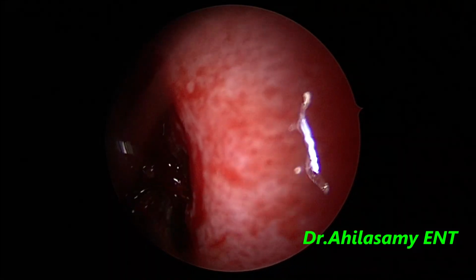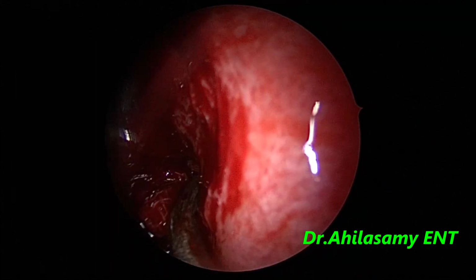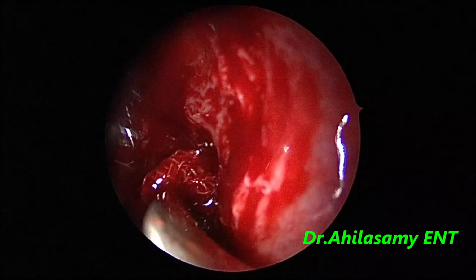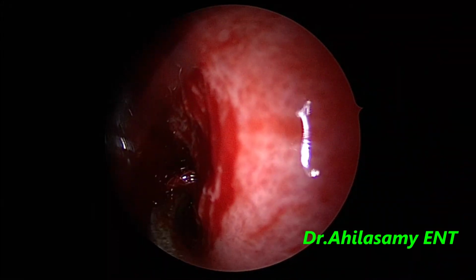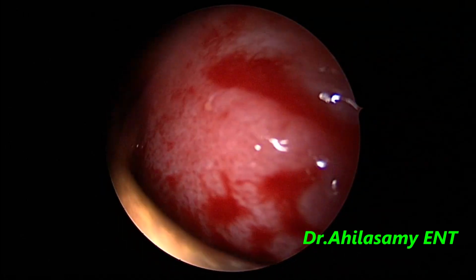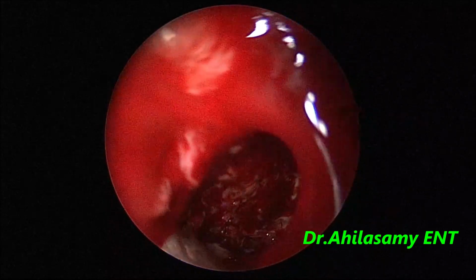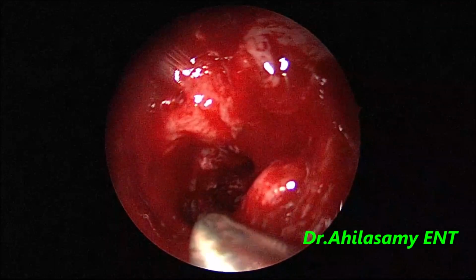Still the field is a little bloody, but lesser than the GA field, unlike the typical local field, because of a lot of inflammation. All those roller gauzes will be wiped and taken out. I can use the malleable ring also to mop it off and take out. Sinuses still some, once more I clean and it will be done. Now it's clear.